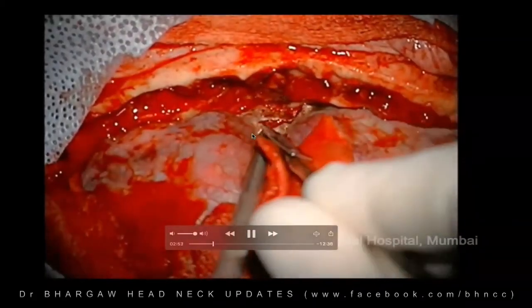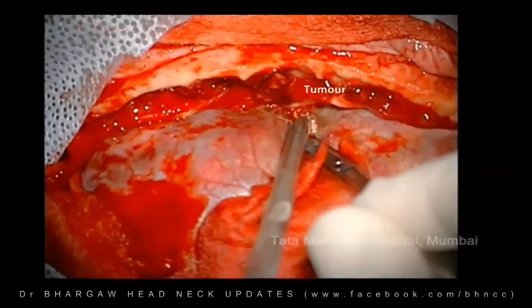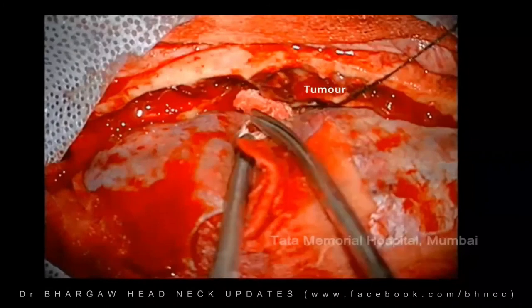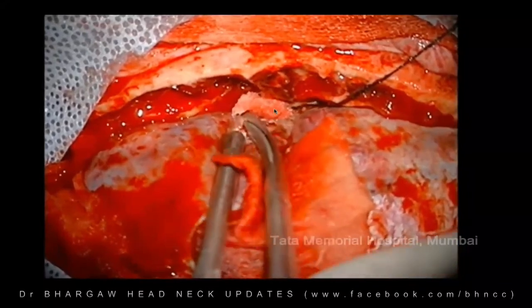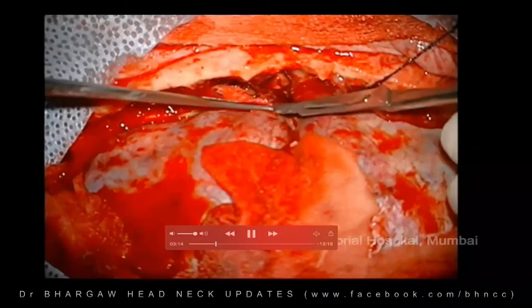Inferiorly, we're just incising the dura. You can see some amount of disease coming intracranially there. Since disease is seen there, we are going beyond for a margin and resecting the dura beyond the disease that is seen. The disease is more on the left side compared to the right.